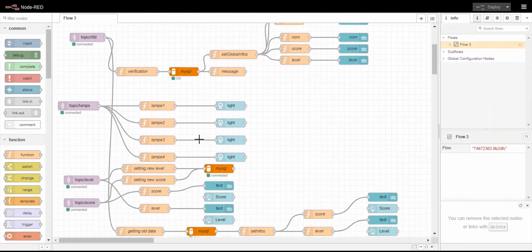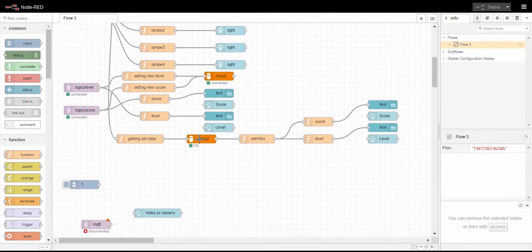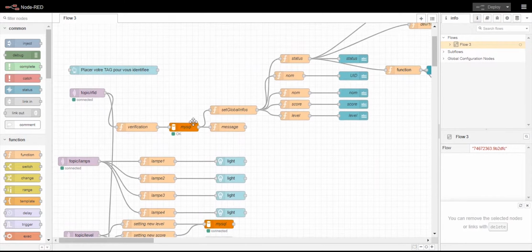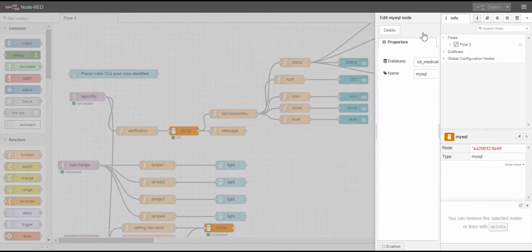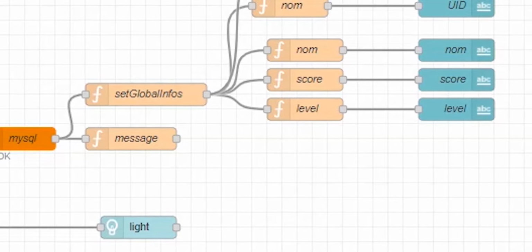In the flow, we find the map of all the components. These nodes are the link between the Raspberry Pi and the web server. For example, let's check this box here. Here we can see the query that selects data from the database. In the next box, we see a connection to the database. And in this set global info box, we can see that it's an if-else statement. Either the user is there or not.